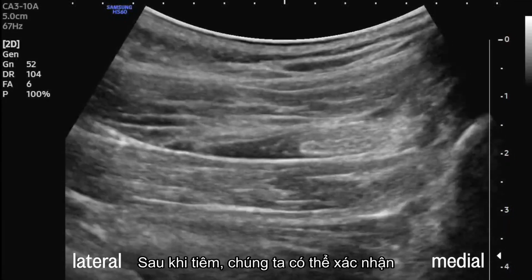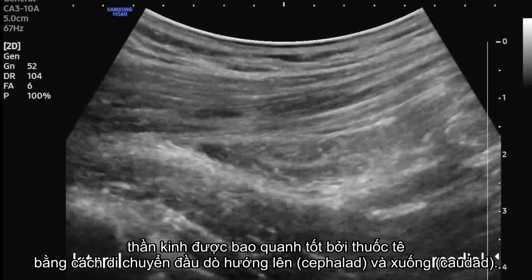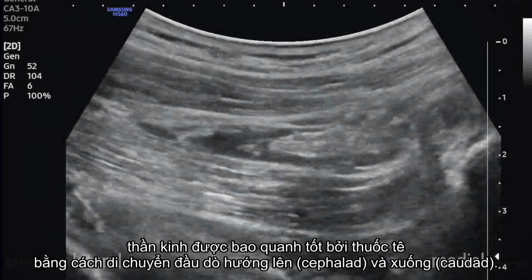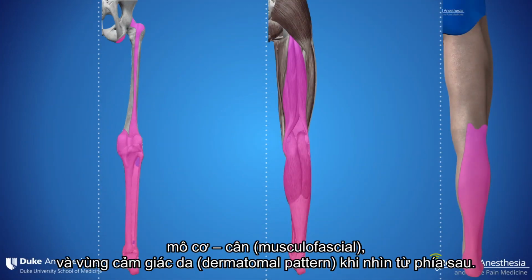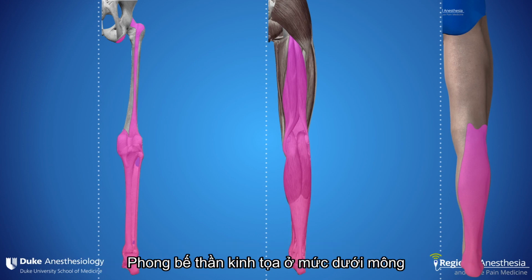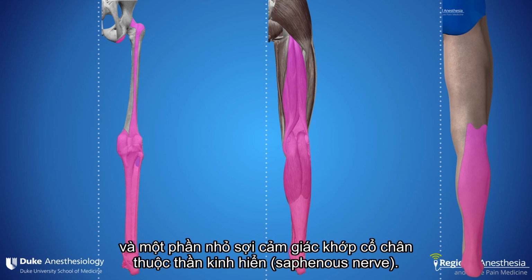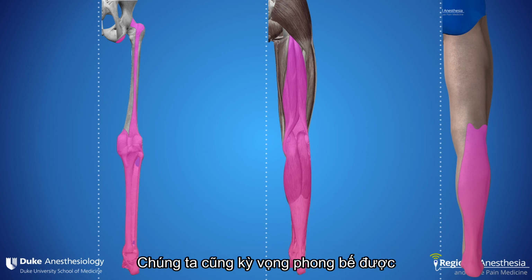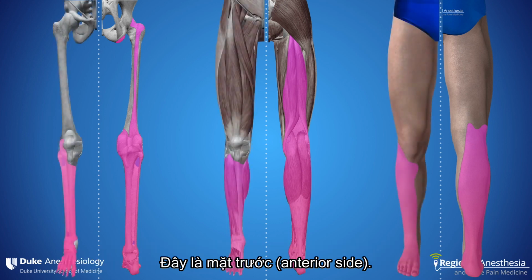Following the injection, we can confirm the nerve is nicely surrounded by local by tracking the probe cephalad and caudad. Here's an image showing the osteal, musculofascial, and dermatomal pattern of blockade from the posterior aspect. Blockade of the sciatic nerve at the subgluteal level will anesthetize nearly the entire lower limb below the knee, save for the skin and small ankle joint fibers from the saphenous nerve. We also expect to get some periosteum on the posterior femur, as well as a motor block of the hamstring muscles. Here's the anterior side.